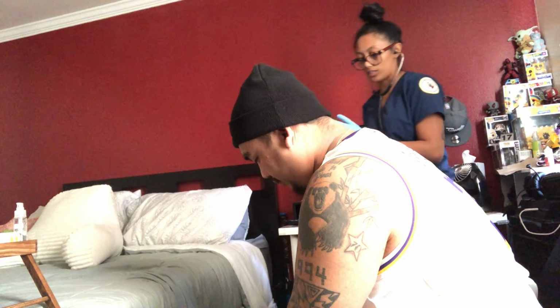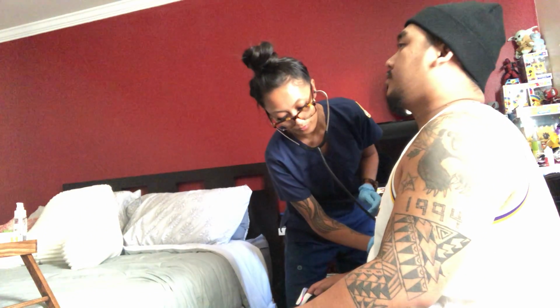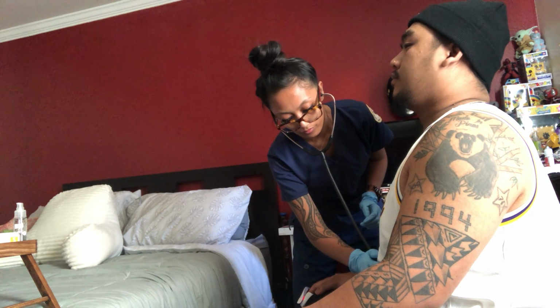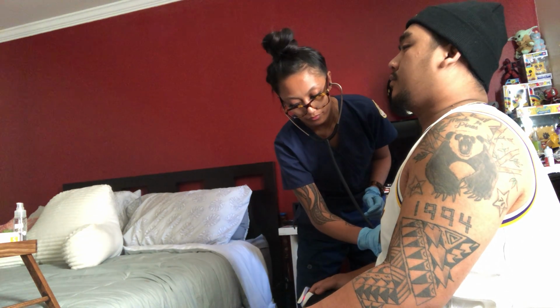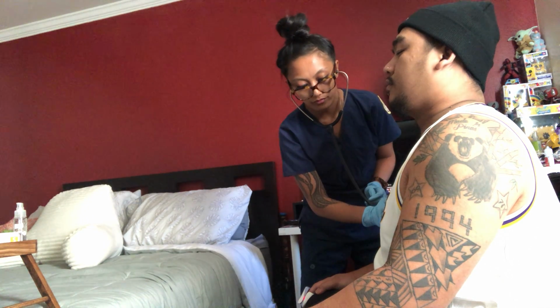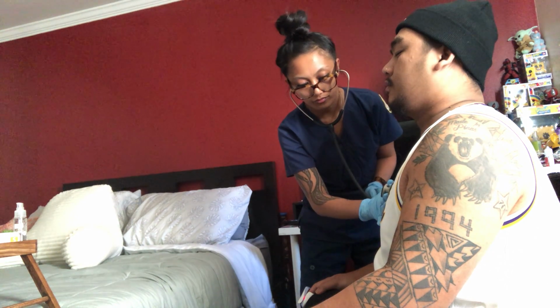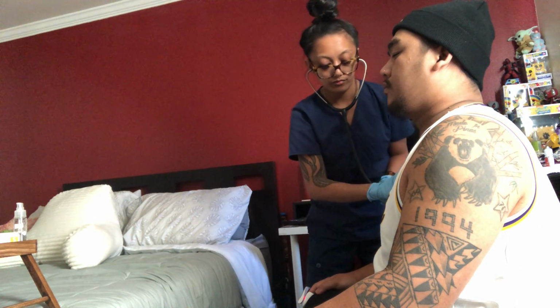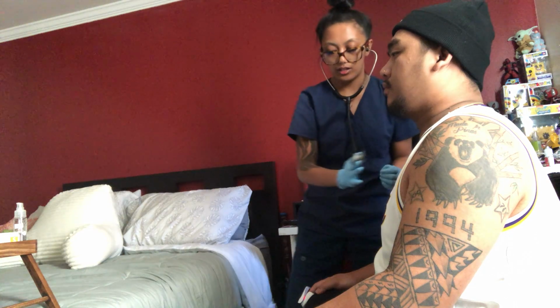Okay, listen to the front. Okay, and then the sides again.